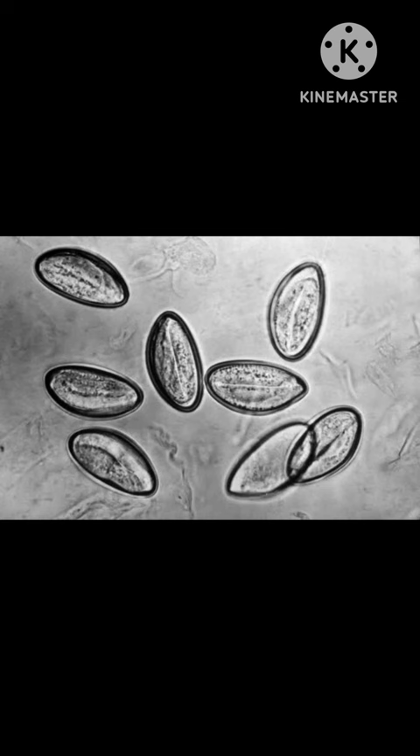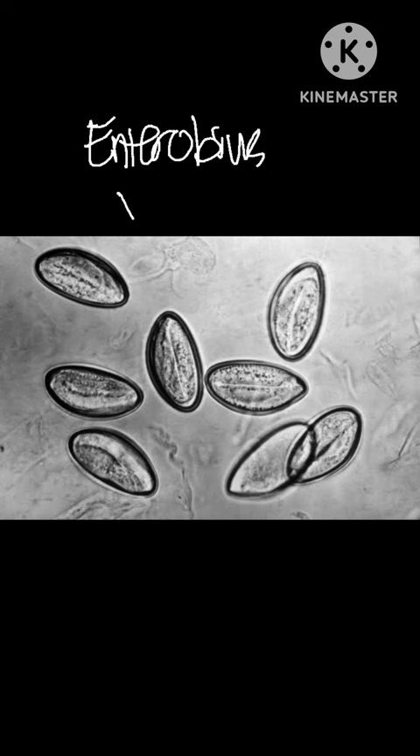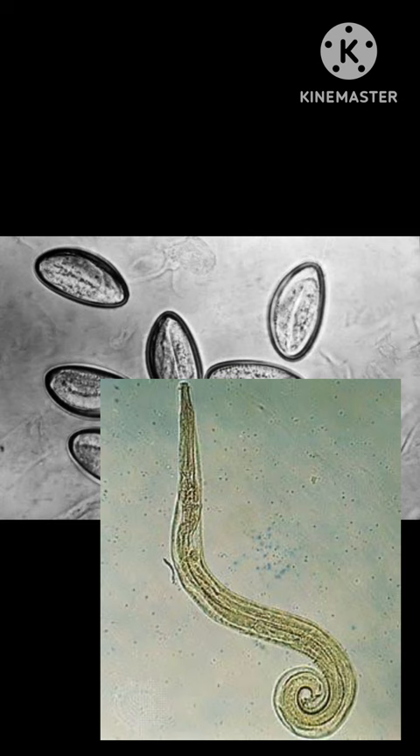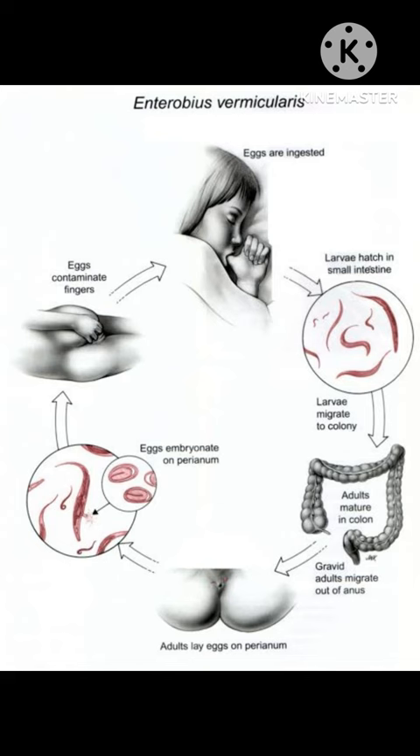If you can remember in your lecture, this talks about a very important nematode, and that is the Enterobius vermicularis. This is a common intestinal parasite or helminth, especially for us humans. The other term used for Enterobius vermicularis is pinworm.